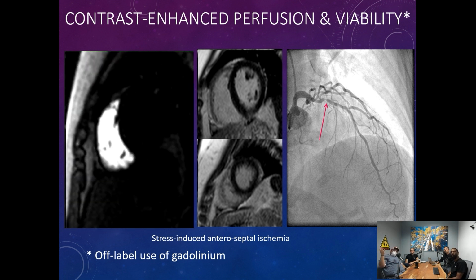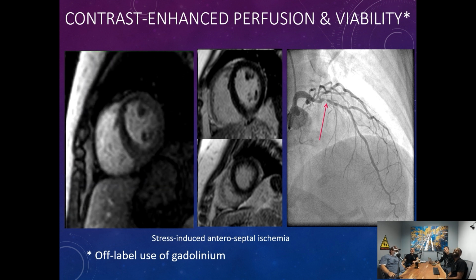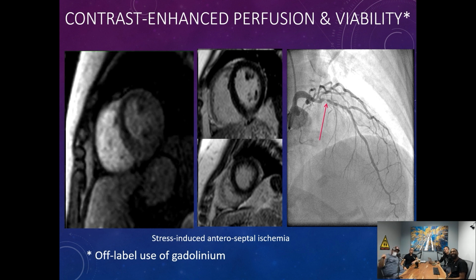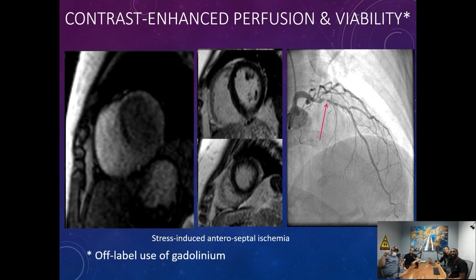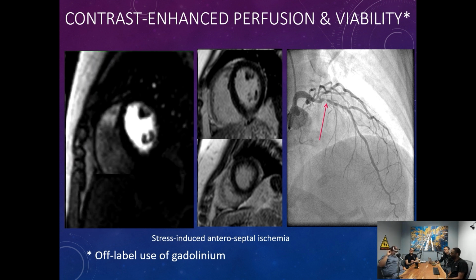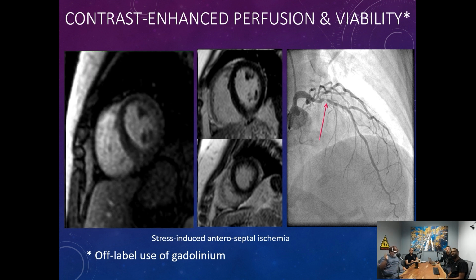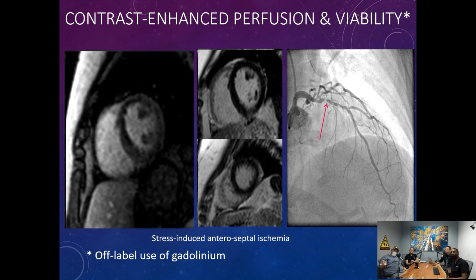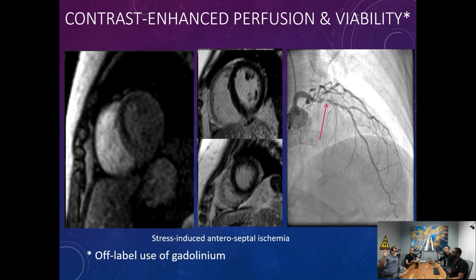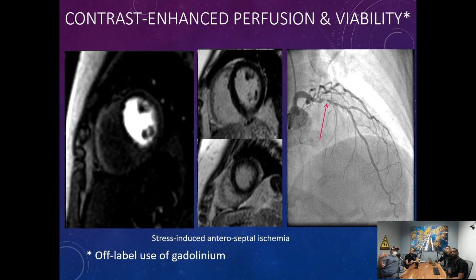If you're not used to looking at cardiac MRIs, you might say, why isn't this guy's heart beating? But it's moving up and down. This is an ECG gated study where basically we're looking maybe 70 times at the same slice, but we're only looking at the heart at a specific point in the cardiac cycle. We're not watching the heart beat. We're usually only looking at late diastole. That ECG gating takes into account the heart beating, and we're only looking at one specific point, so the heart doesn't look like it's moving. But we're looking at that point over and over again over time.